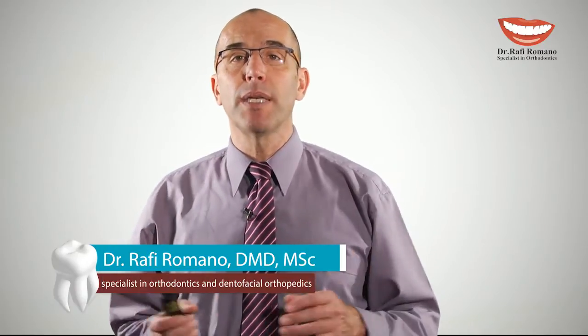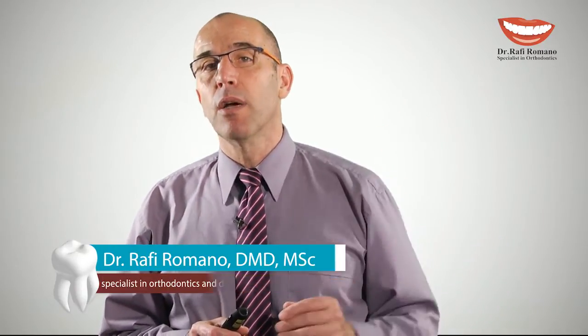I'm very honored and pleased to present you the sixth part of the presentation of the Joy bracket by Adenta, a lingual bracket, a very small one, very nice for minimal to moderate teeth movement.